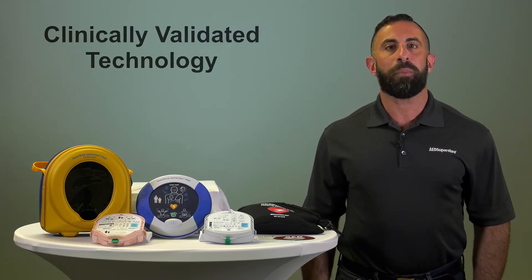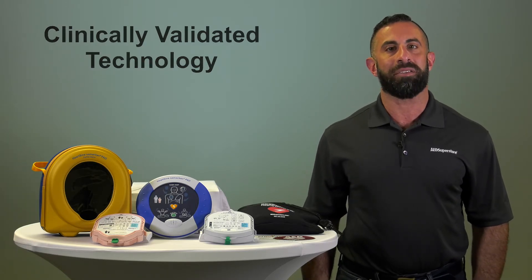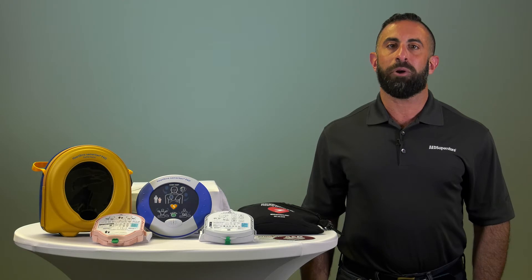HeartSine uses scope biphasic technology that automatically adjusts for differences in patient impedance. The unit is available in both semi-automatic, the 350p, and fully automatic, the 360p.